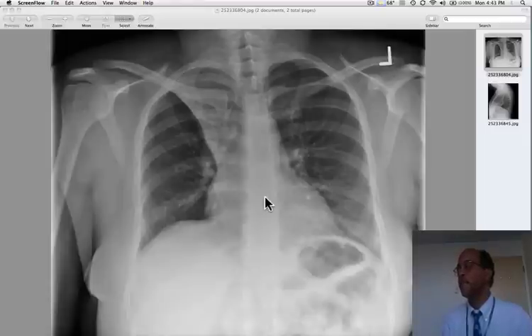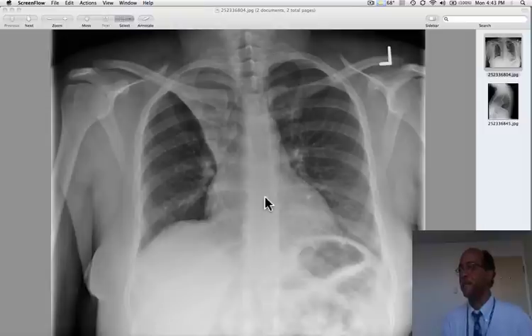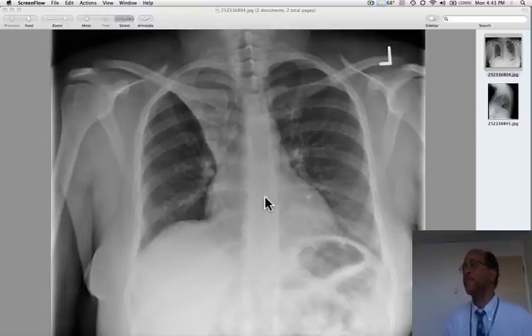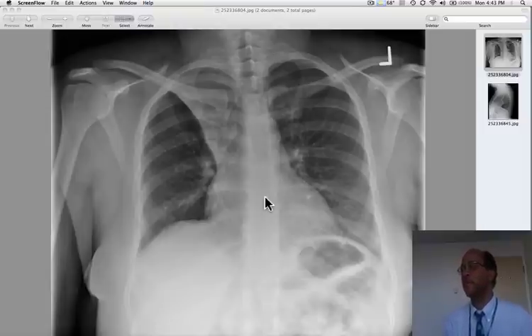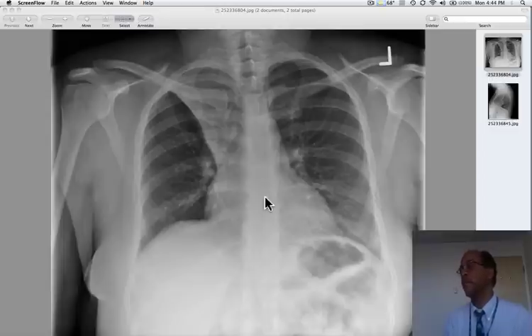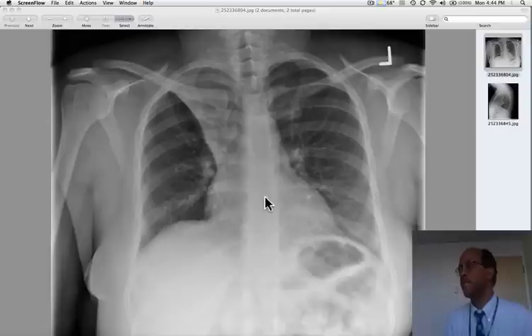Today we continue our theme of atelectasis. This is a patient who comes in with asthma and exacerbation and thick sputum. He's afebrile. We get this chest x-ray and we see that it's remarkably abnormal.